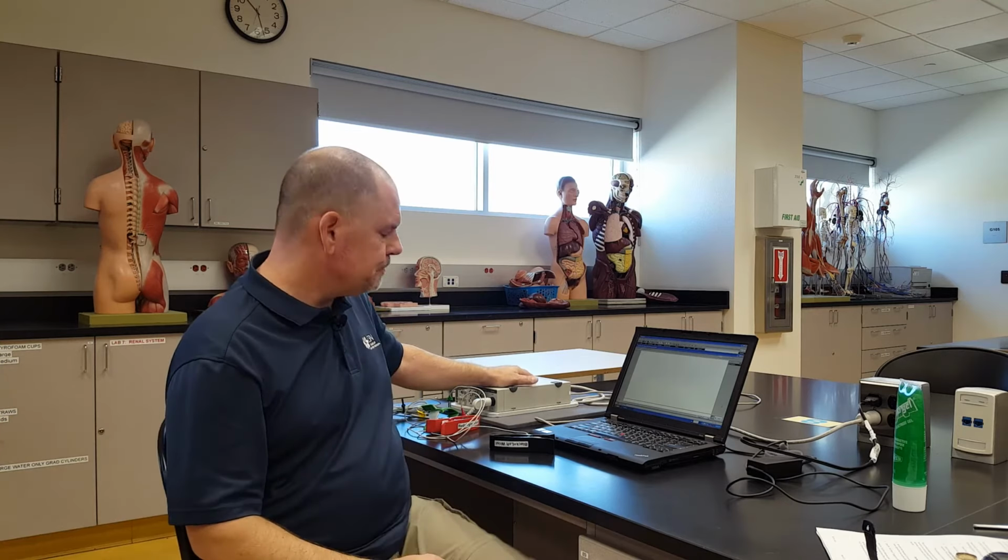The first thing that you always want someone to do is take off any jewelry or electrical appliances, watches and so on, from their wrists and their hands. You also prefer to have them in an electrically isolated room. Maybe some of you working in the field or as a patient have seen that ECGs are sometimes recorded in a room with the lights low and not a lot of electrical appliances. In this particular lab room, the electrical activity in our ceiling and walls can disrupt our electrocardiogram. That's why I try to isolate the box as much as I possibly can.